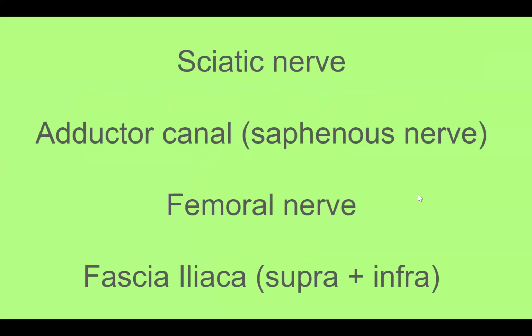Blocks. So super helpful, I think, throughout the Pacific, not only just for intraoperative analgesia or anesthesia, but also for post-operative analgesia. So the nerve blocks that I'll focus on today are ones that can be identified with the PEARLS probe, the butterfly probe. So I'm going to cover 4 main nerve blocks today.